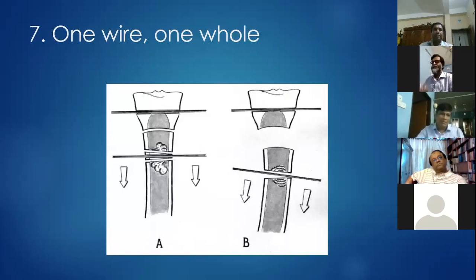And rule number 7, the last rule: one wire, one hole. Each wire drilled through the bone must be introduced correctly at the first attempt. Multiple holes resulting from incorrect wire positioning destroy compact bone through mechanical damage and through burning, and this destruction can result in weakening of the wire fixation. Multiple drilling through the bone marrow significantly destroys its blood circulation, causing hematoma formation, delaying its ability for new cell development, and may even contribute to infection.